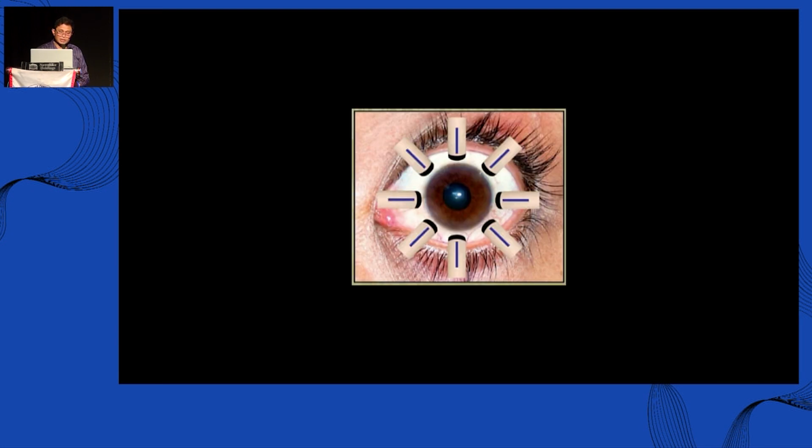So when you do that, you really see the opposite side periphery and the posterior pole, and then keep on going. So the transverse, and you go around 8 times, you go around, and then you can see what you want to see.